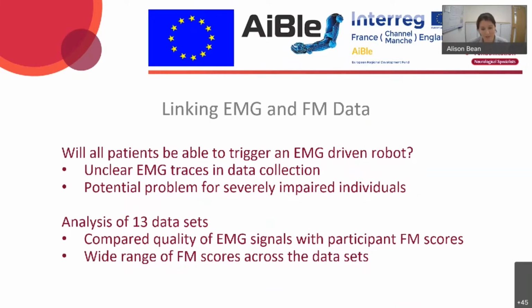Midway through our data collection, a question arose as to whether or not all of the patients would be able to trigger an EMG-driven robot. And this was due to some traces being unclear in data collection, hindered by noise, potentially by that handling, as I've just shown, or just generally proving difficult to analyse. So we wondered whether this was more problematic in severely impaired individuals. And we further hypothesised that therefore the severely impaired individuals who had difficulty generating EMG signals may also have difficulty triggering the final robot. And we decided we needed to explore this further.